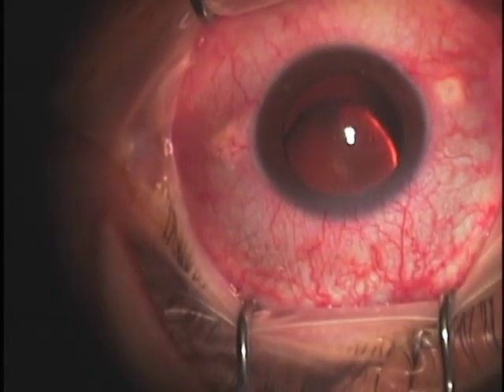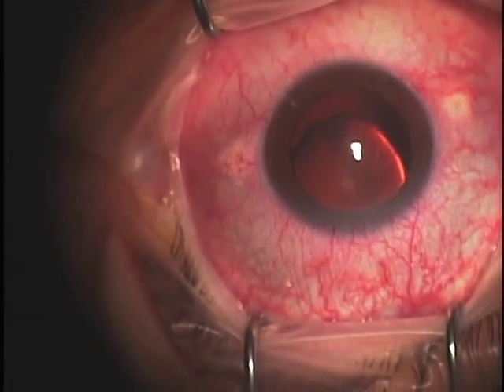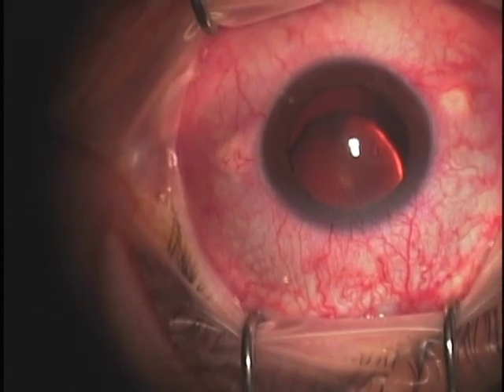This 47-year-old patient has a subluxated lens and has vitreous in the anterior chamber, showing us that we will see vitreous during this intracapsular cataract surgery.